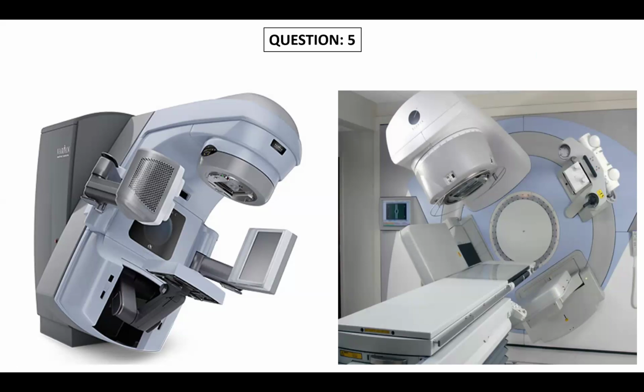Yes, sir. Through the linear accelerator, we can treat with both X-rays and electrons, sir. And we can use different energies starting from 6 to 15 MV photons, and we can use, as you told, MLC, so that we can use it for beam shaping and field shaping to treat the target accurately. Can you say something about MLC in depth? Sir, it's a multi-leaf collimator, sir.